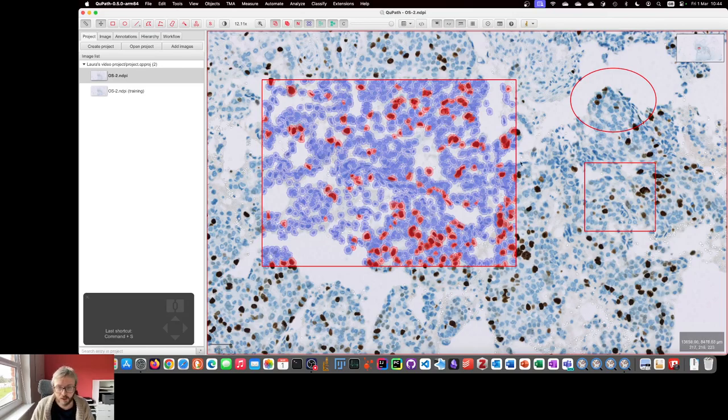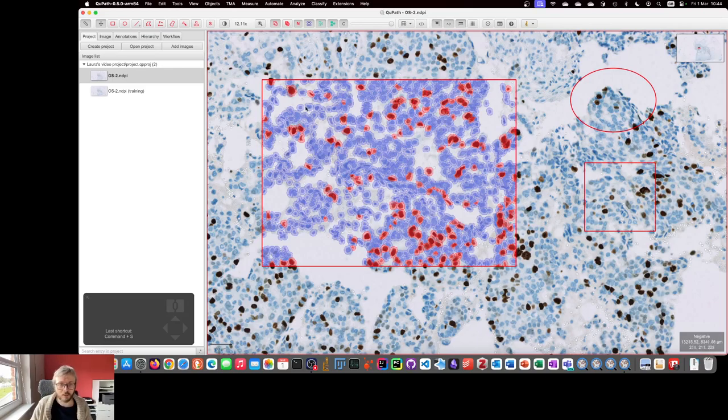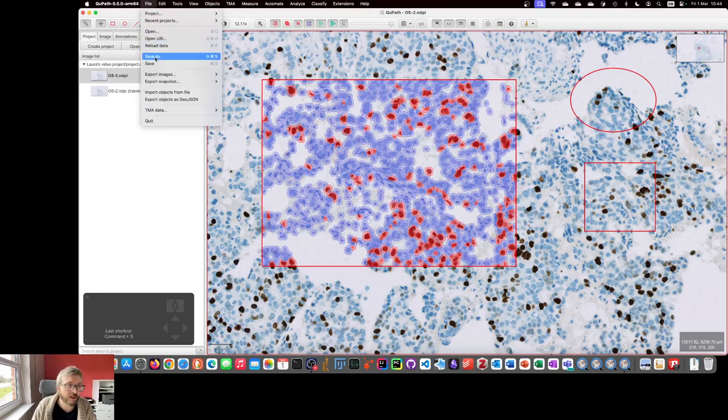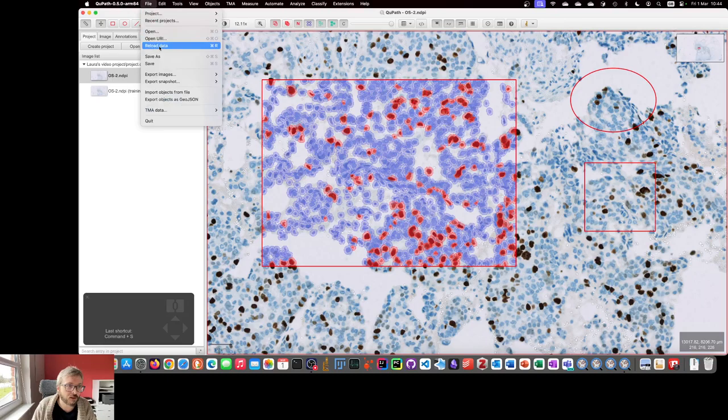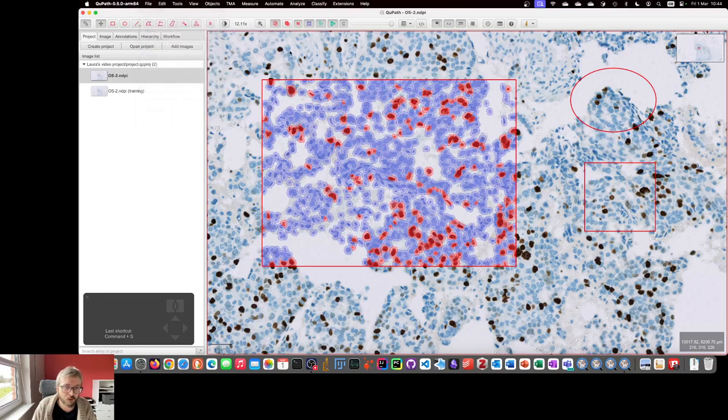Okay, so to begin with, I've created a few different annotations. They're the ones that we see with the thick red outlines and then cells inside them. I have saved it, which means I can go to File, Reload Data at any point to get back to the state where I currently am.